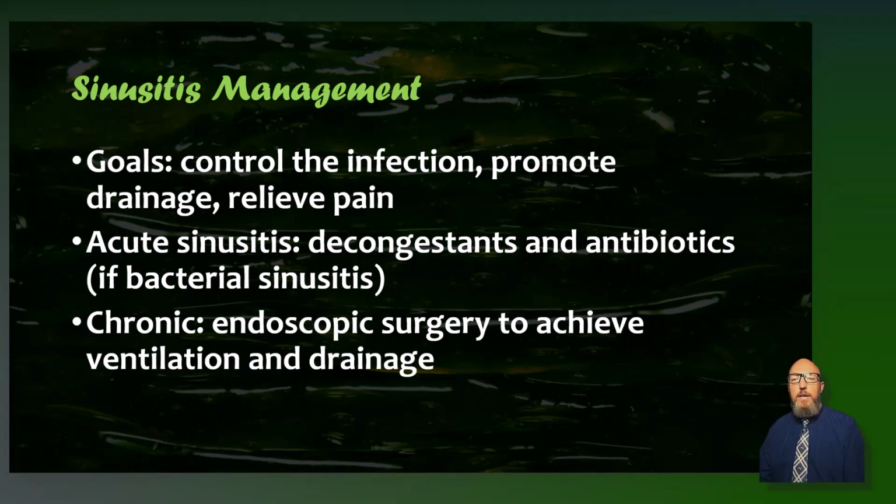In the second video, we'll turn to the masses that occupy the sinuses, escalating from the harmless antrolith and osteoma to the destructive mucocele and then carcinoma. We'll finish with a single rule that determines when you do refer.